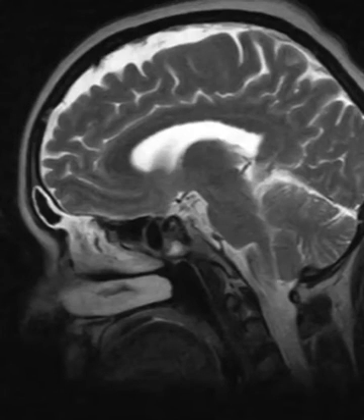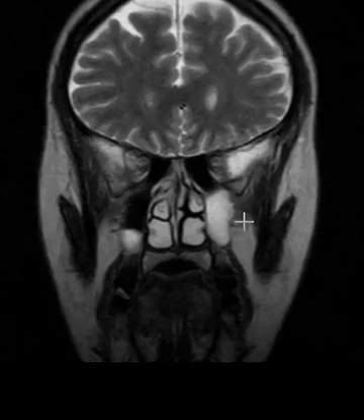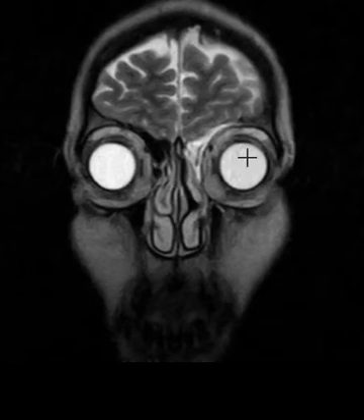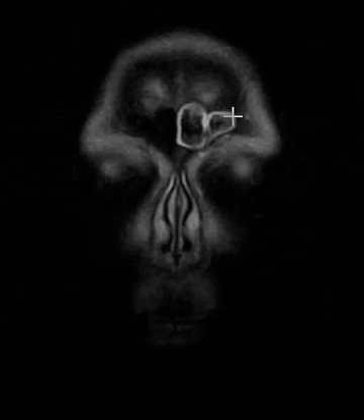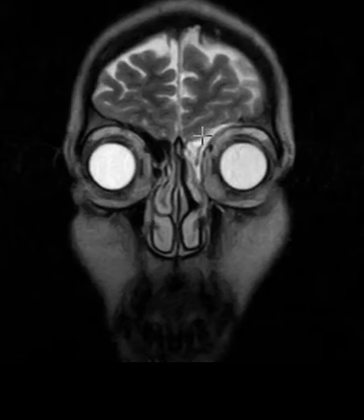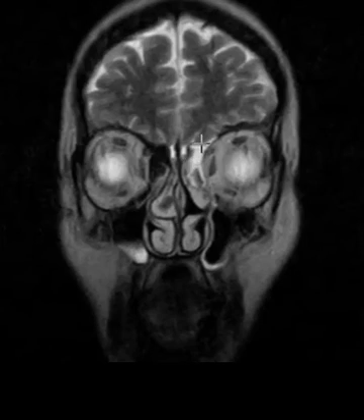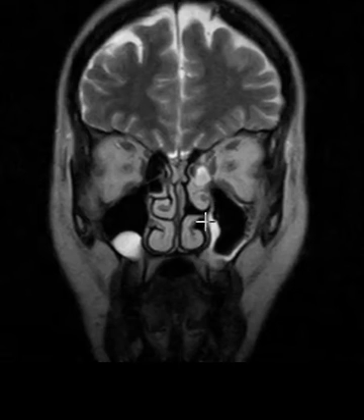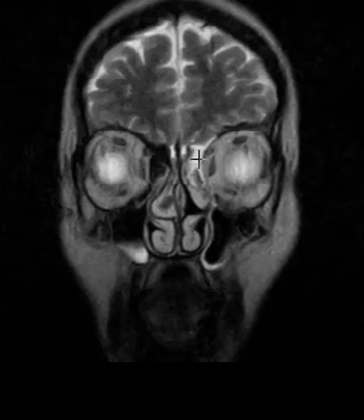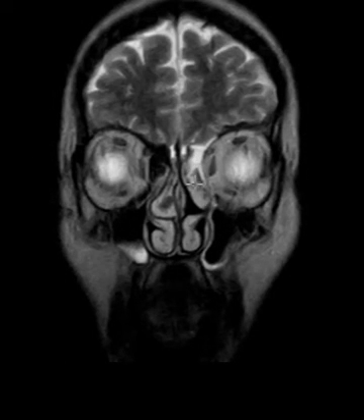Pressure gradients can cause sinus headaches, and this shows up best on coronal images. On this view we can see one eye here, the other eye here, and the nose in the middle. We can see the left frontal sinus with brightness indicating mucosal thickening or inflammation. The right side looks normal while the left has mucosal thickening. That frontal ethmoidal recess is completely filled and occluded, causing pressure headaches. Going down to the maxillary sinus, there is a communication between the maxillary sinus and ethmoid sinus called the ostiomeatal unit, and this is occluded by mucosal thickening.